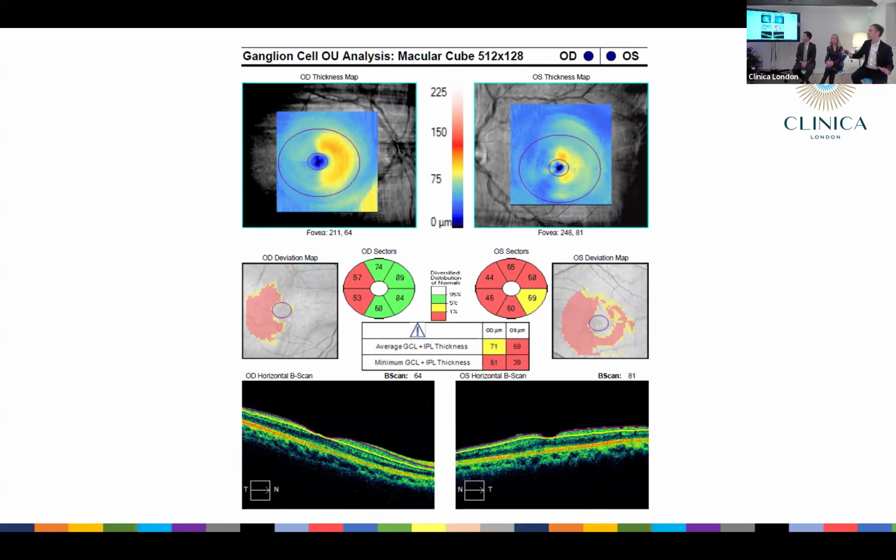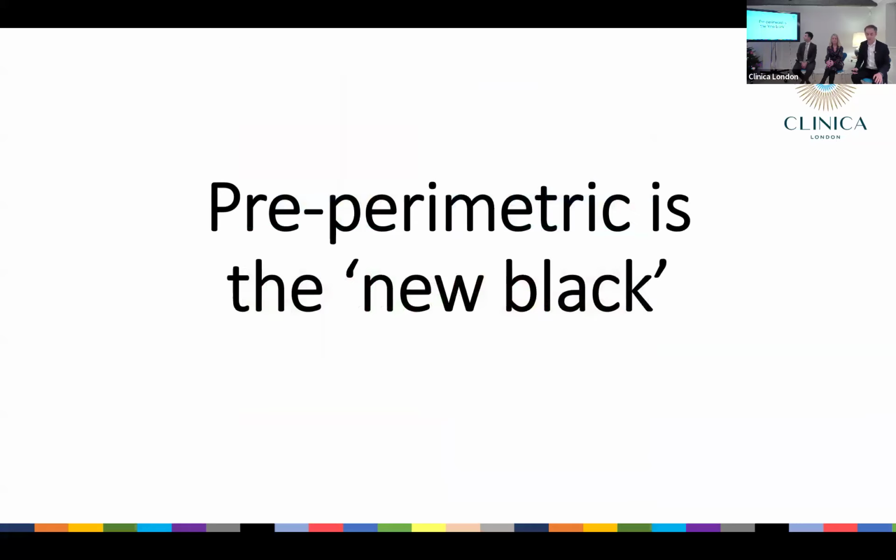So really Minak's covered this already, but a take-home point, macular scan, but also, look, those sectors, there isn't a sector either side of the vertical meridian. You can't see whether something's respecting the vertical meridian just from the sectors. You have to look at the map.